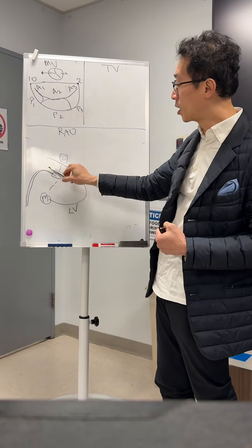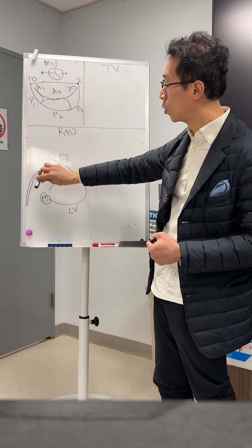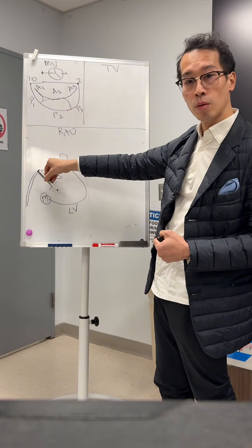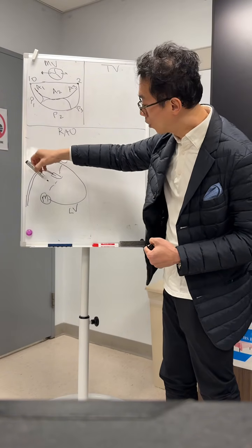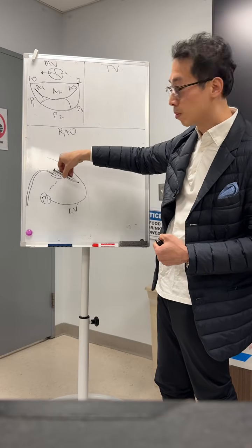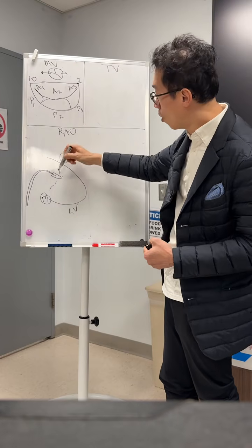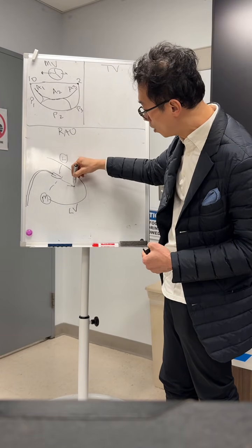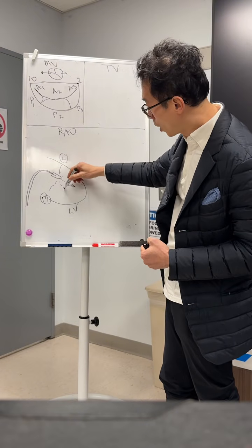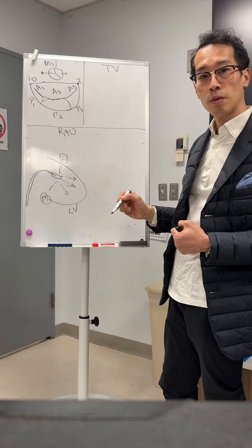or this way for medial. So let's say on the MitraClip system, or even the PASCAL system, if you need to do a kind of extra flex, you're going to go more medial, right? But remember, you want to be perpendicular to the coaptation plane. You don't want to be doing like this, because then you have a medial dive. So what we're talking about, you want to go in like this. You don't want to go in this way, that's a medial dive, and that's a lateral dive.